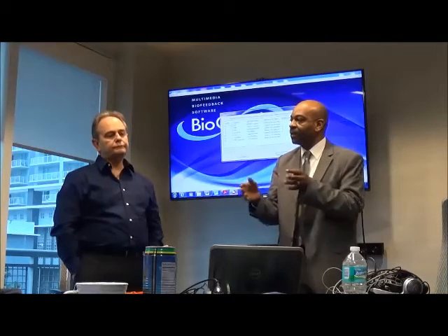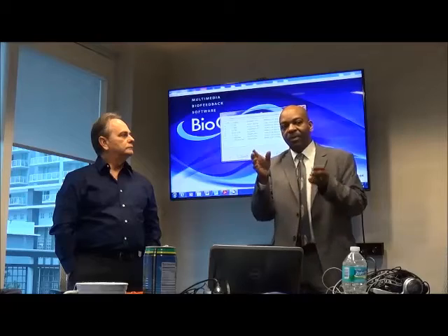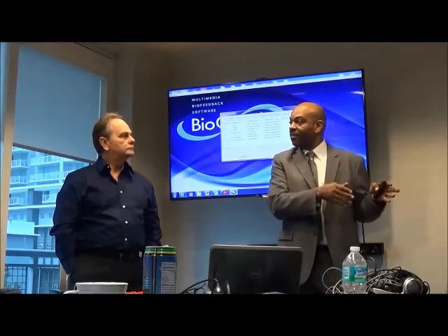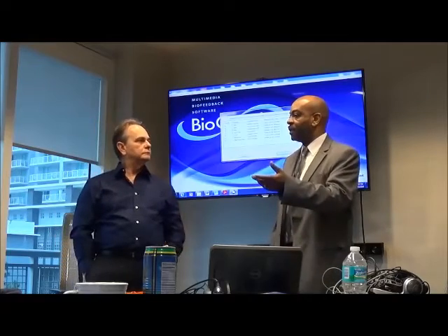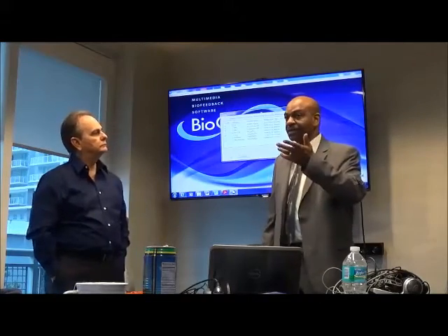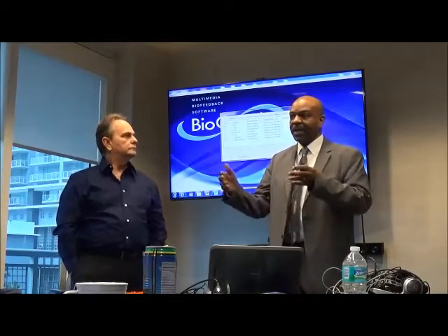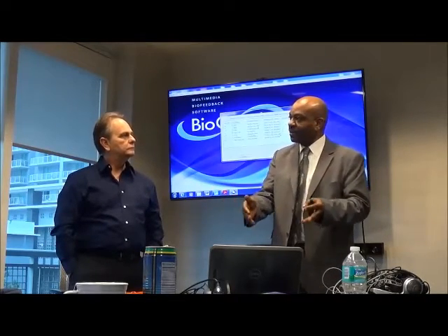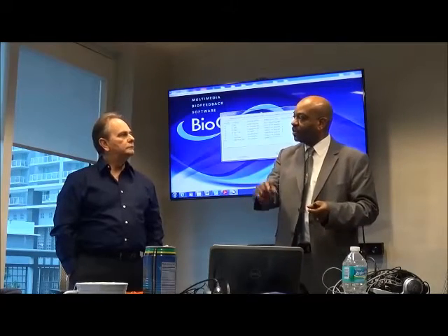So that was, again, another situation where we created a script, because in that case they wanted it to be exactly the same for each subject that was being recorded. And they had different people. I'm not a researcher, so Dr. Palacios would probably give you more detail on it, but you want things to be the same, and you don't want it to be dependent on the person who's doing the test.